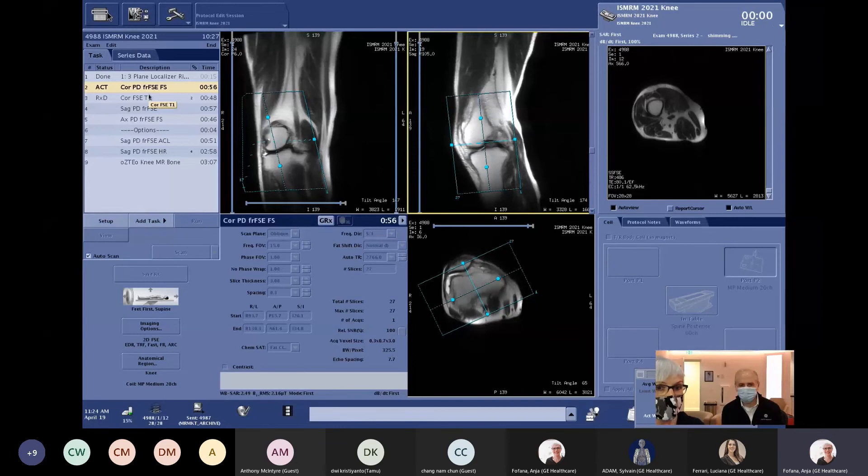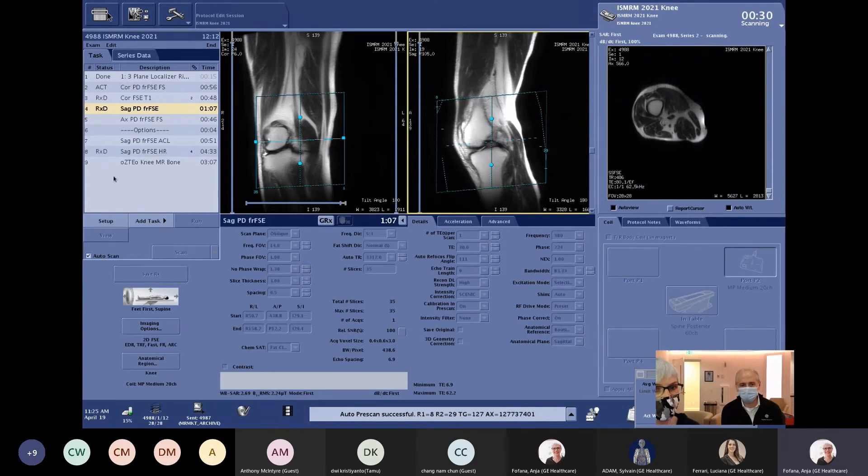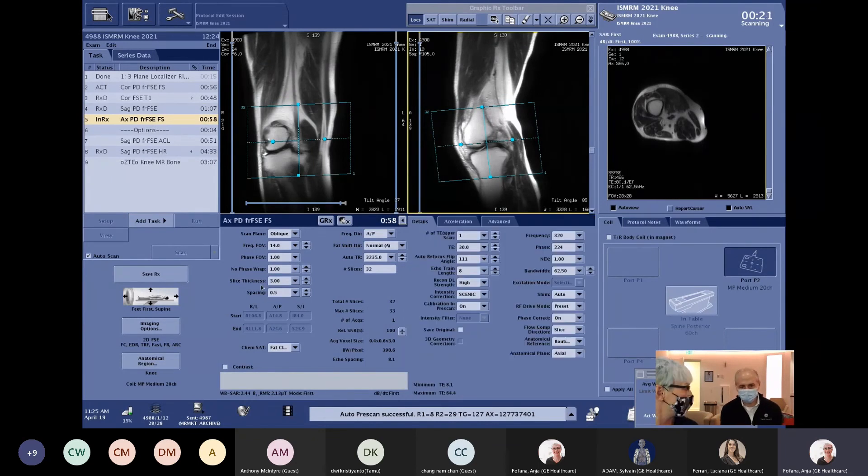The second deep learning feature is Air Recon DL. With this technology, you can typically complete a knee exam without sacrificing traditional spatial resolutions in around five minutes, which is extremely fast. All scan times are around one minute, with 3 mm slice thicknesses and decent in-plane resolution of 0.4 by 0.6. The scan time is around one minute because Air Recon DL is selected and set to high in the details page.